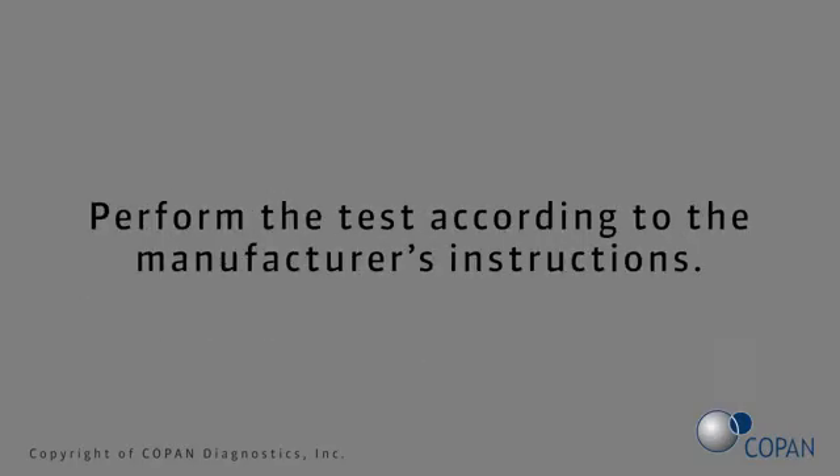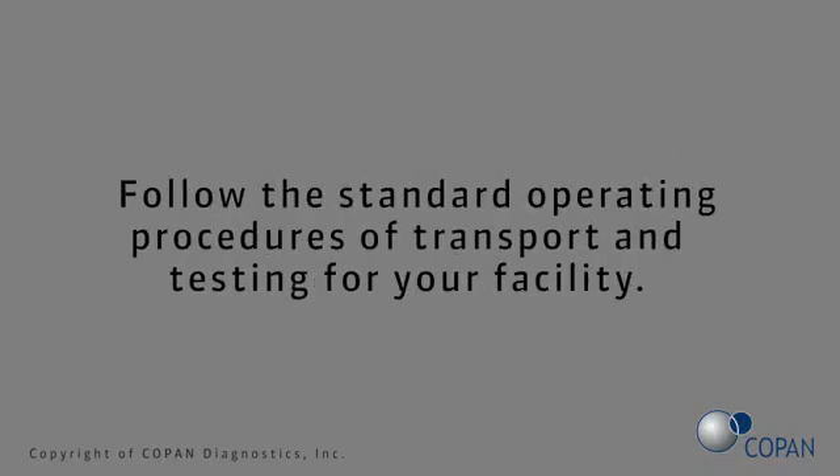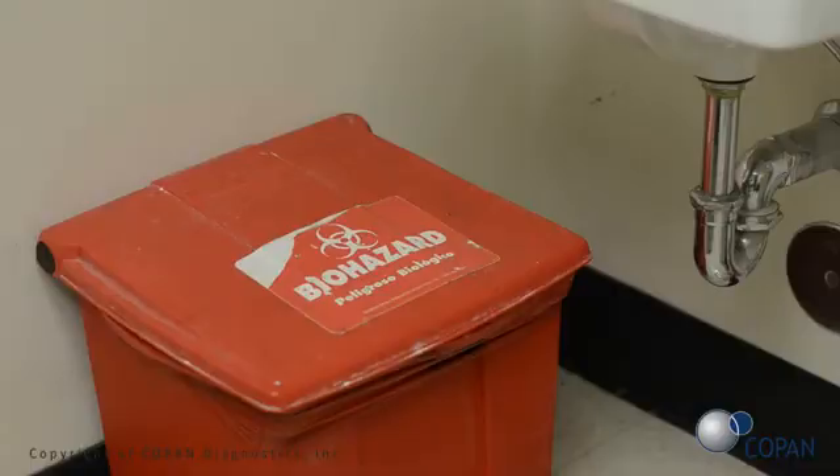Perform the test according to the manufacturer's instructions. If specimen testing is not performed at the point of care, refer to the manufacturer's instructions for transport and storage recommendations. Follow the standard operating procedures of transport and testing for your facility. All biohazardous waste disposal procedures should be followed for your facility.